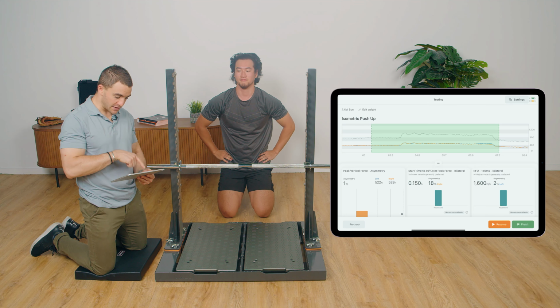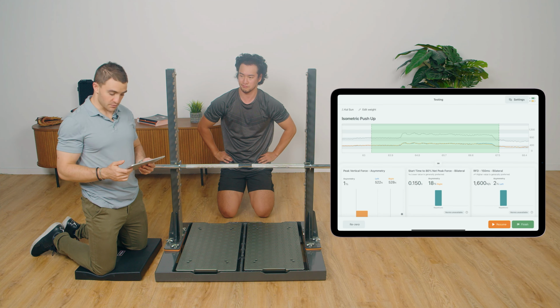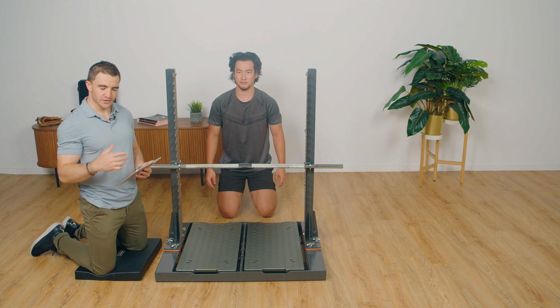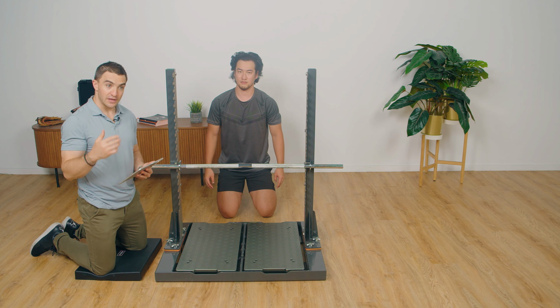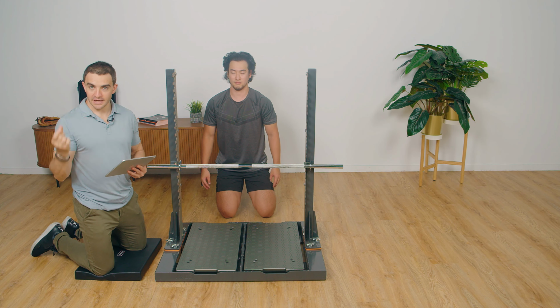But what we're looking at is peak vertical force asymmetry. So when Cal starts to apply force, which arm is producing more force? We also look at start time to 80% of peak vertical force. That sounds like a very sophisticated metric, but what we're really looking at there is, of Cal's overall peak force, how long does it take him to get to 80% of that?